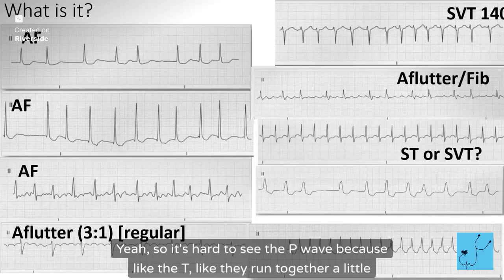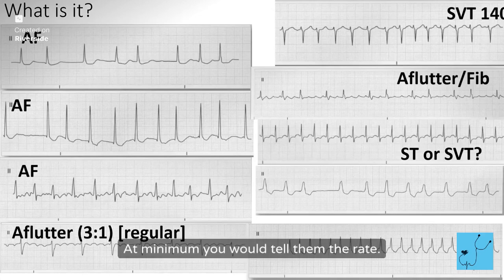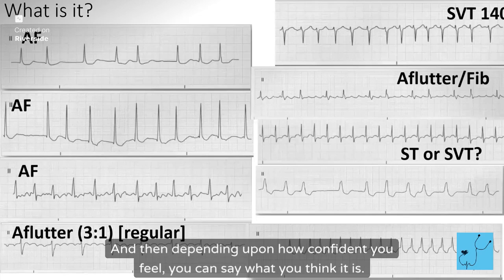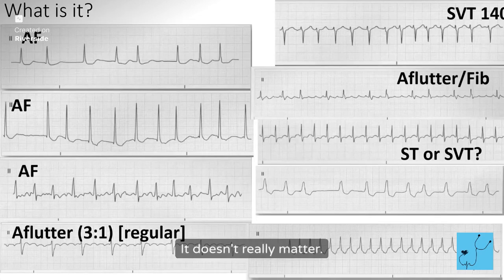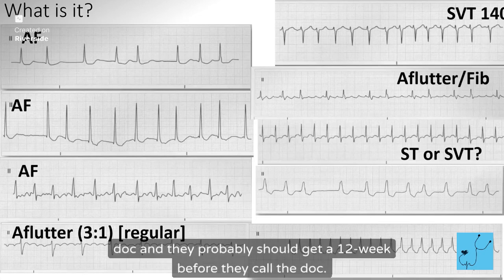Yeah, so it's hard to see the P wave because the T and P run together a little bit, right? And it is regular. It's narrow. At minimum, you would tell them the rate. You'd say the patient's heart rate is 160. And then depending upon how confident you feel, you can say what you think it is. It doesn't really matter. They're going to have to go look at their patient and call the doc, and they probably should get a 12 lead before they call the doc.